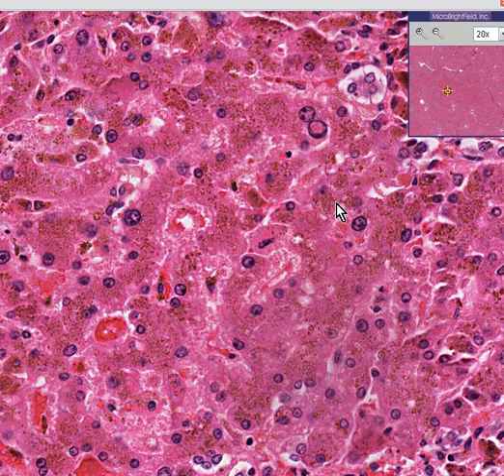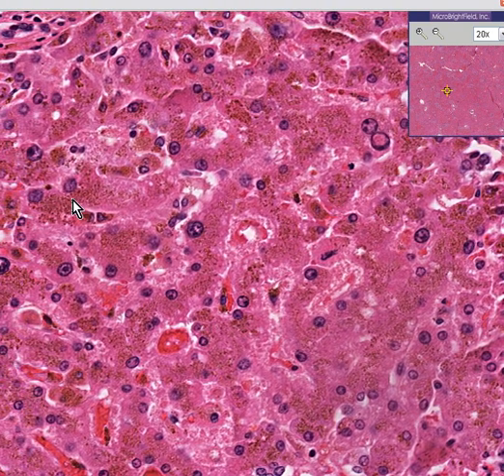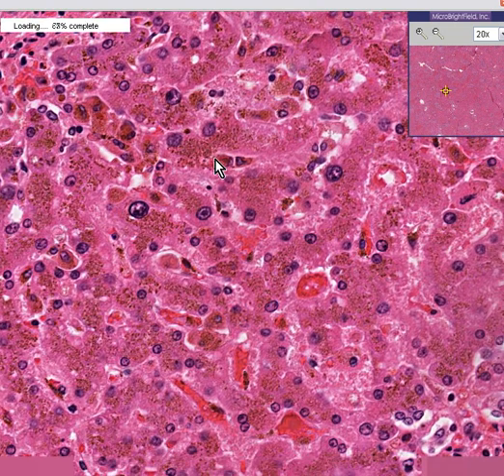Now I know what you're thinking. You're thinking, well, why can't this be bile rather than iron? Actually, it could be, but if you did a Prussian blue stain, you would see that this granular material stains very intensely blue. This is hemosiderin, the end stage of iron metabolism in the body, loading most of the hepatocytes. All this granular stuff here is iron.